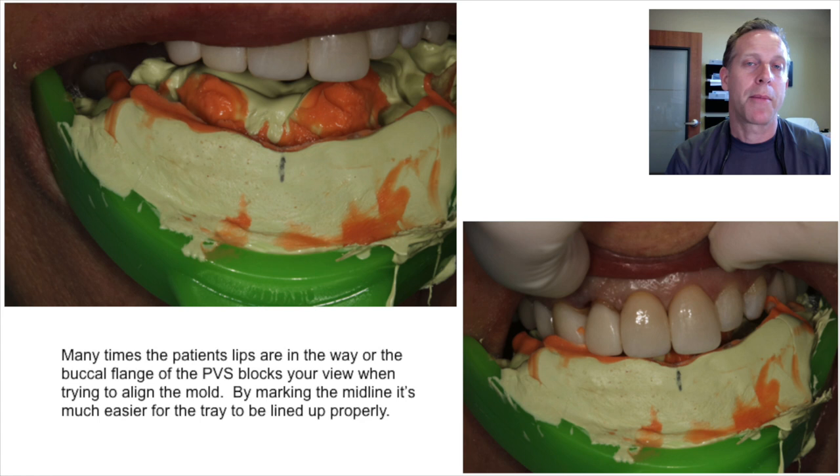By simply taking a ballpoint pen and marking on the buccal flange where teeth 8 and 9 are located, it makes it much, much easier when you're trying to insert this back into the mouth to get proper seating.